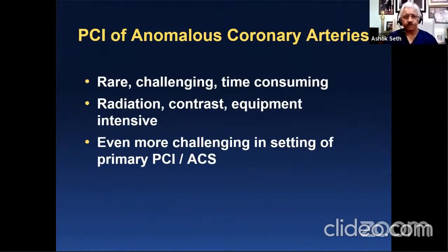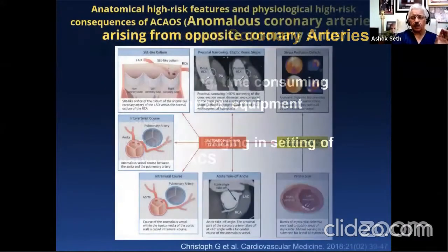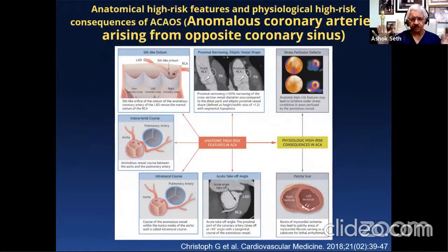So therefore, you're going to get some vignettes of my experiences around PCI and anomalous coronary arteries. Now, I want to tell you, we're not going to be discussing any theory around anomalous coronary arteries or the classifications or whatsoever. We're going to discuss practical points of PCI in anomalous coronary arteries.